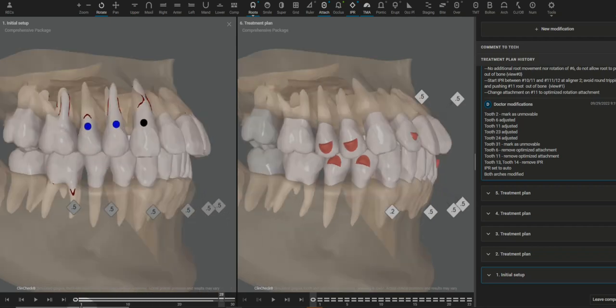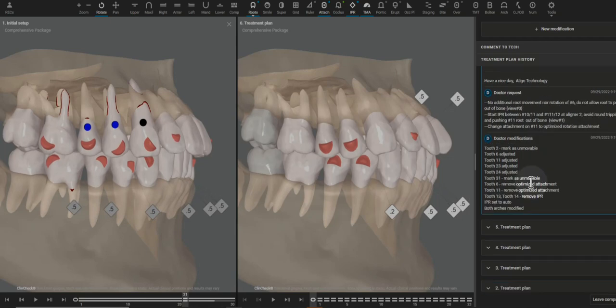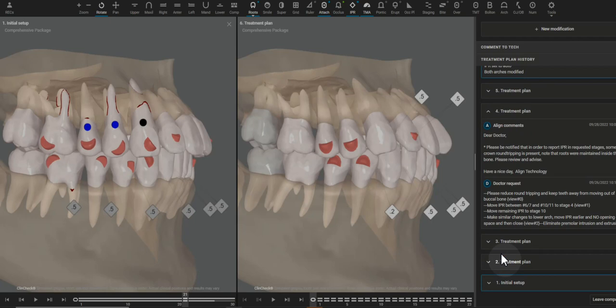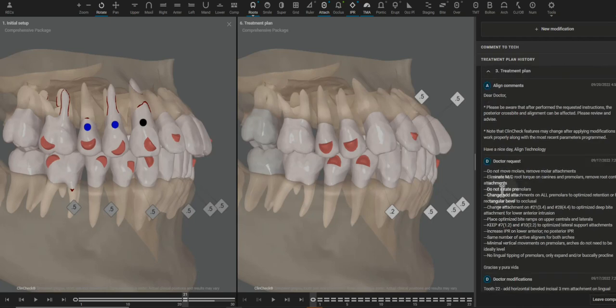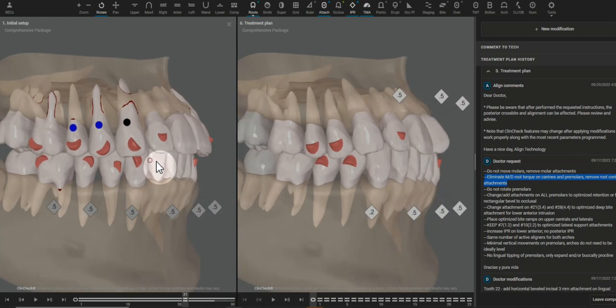So we want to ask to eliminate all mesiodistal root movement, which I did with the 3D controls. This is one of my favorite things to write. Once I see it on the premolars, I ask to go ahead and eliminate it from the canines as well.